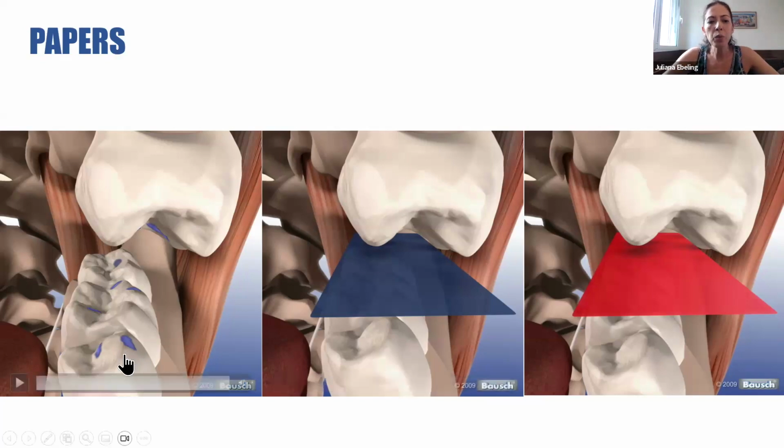So the right interpretation of this contact is: here the center that is clear is the most intense contact.